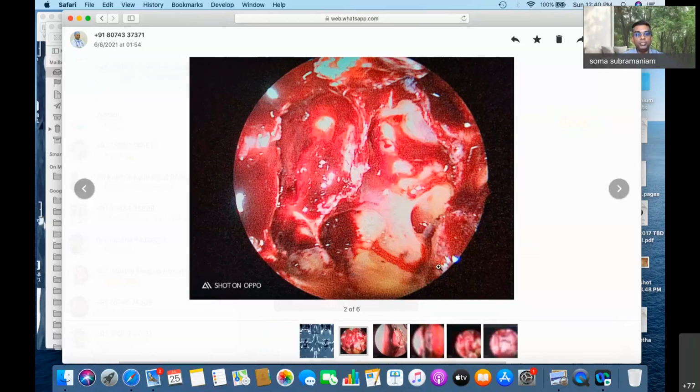You did your surgery mostly, I mean, you have done obviously a fantastic job. So whatever I say doesn't really matter. If you've got enough experience, you can do it right side, left side, upside down. It doesn't matter. But for a beginning surgeon, I would have recommended going through the left side. Okay. Thank you very much. No problem. Great job. Thank you.